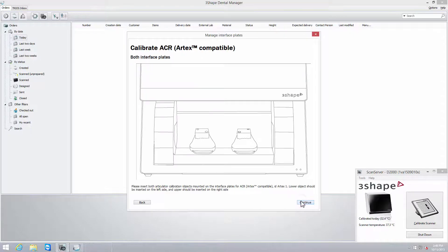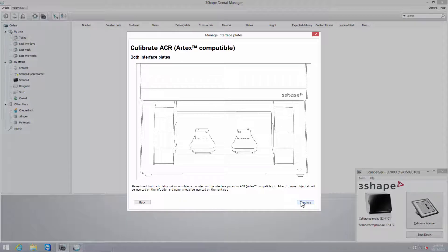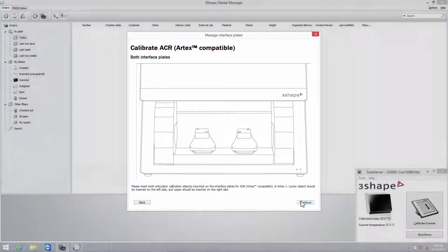The pop-up window gives you a hint on how to insert the object in the scanner, depending on the type of scanner.